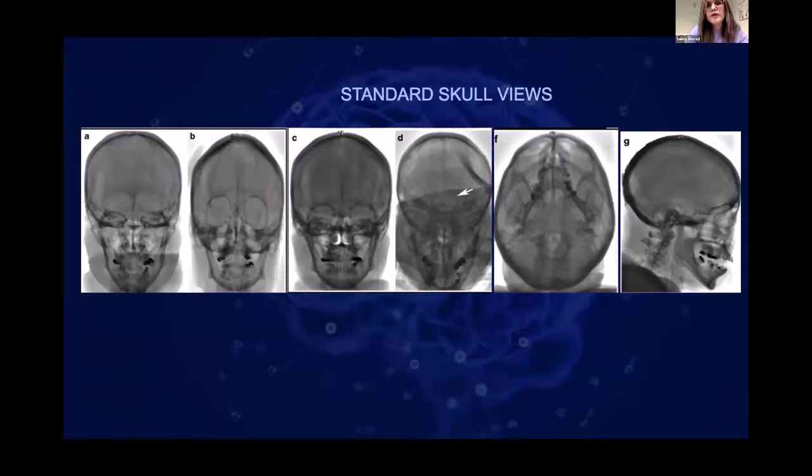Normally we use AP and lateral, and we have to see the arterial, capillary and venous phases in two standard views. This is for neurointerventional procedures. In peripheral intervention, you can use one plane. That's why we use both planes, because we have to see the AP and the lateral. Conventionally, we have to see the arterial, capillary, and venous phases. The physiological perfusion time is about 3.5 seconds, in which you can see the arterial, capillary, and venous phases.